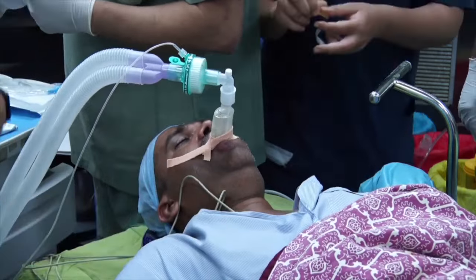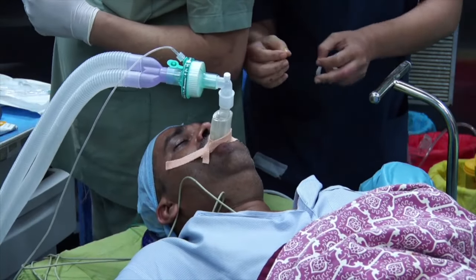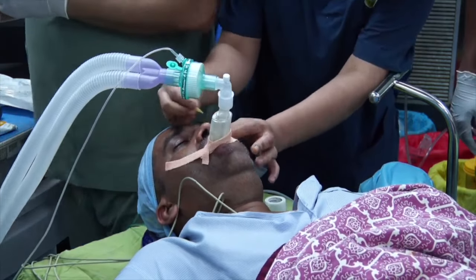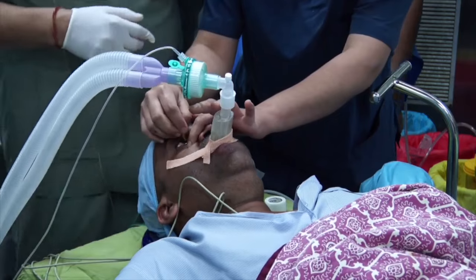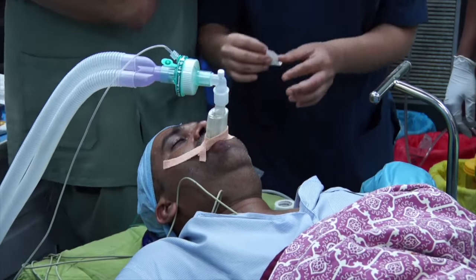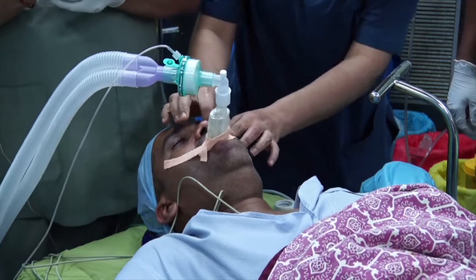Please tape the eyes. The MAC is one — let's leave it at one MAC for now. The concentration of the inhalational agent is one MAC. Once you do the block, you can actually come down to around 0.7 to 0.8 MAC.